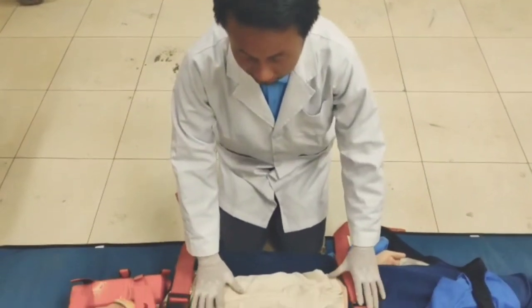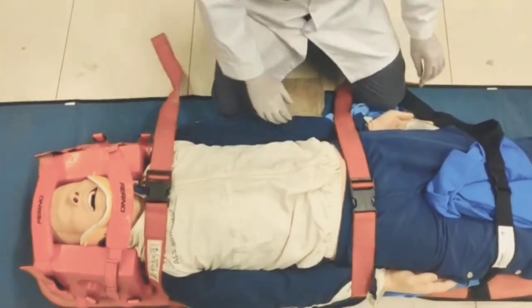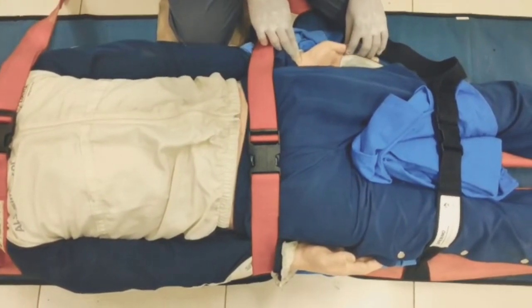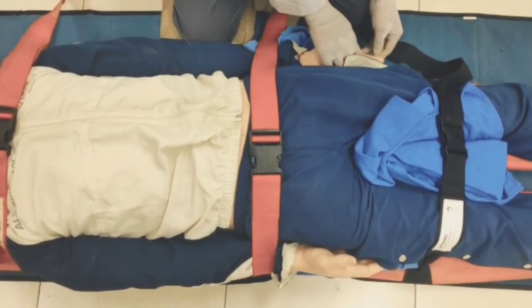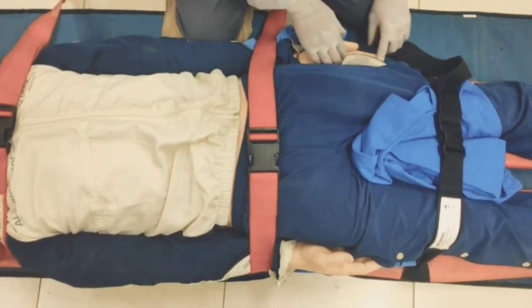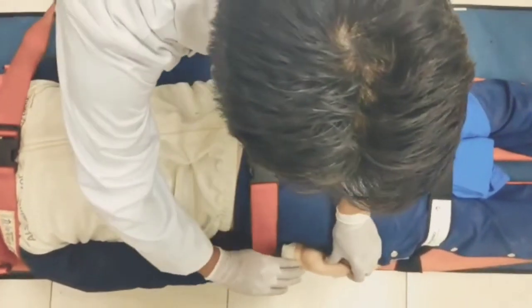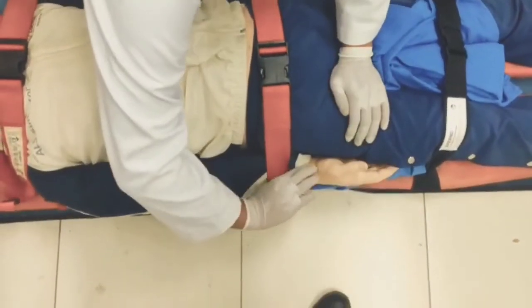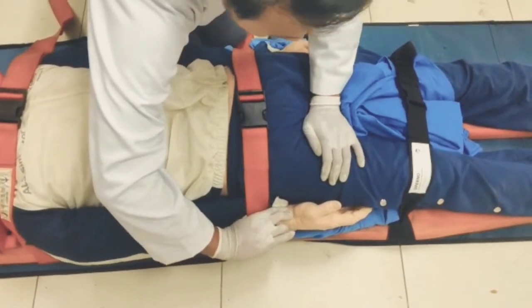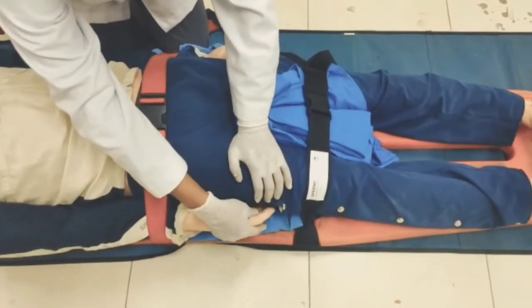After the patient is secured on the spinal board, we have to recheck the PMS. His pulse is strong and regular. His capillary refill is less than 2 seconds. Can you move these fingers? And we have to check the other hand also. His pulse is strong and regular. His capillary refill is less than 2 seconds. Can you move this finger?